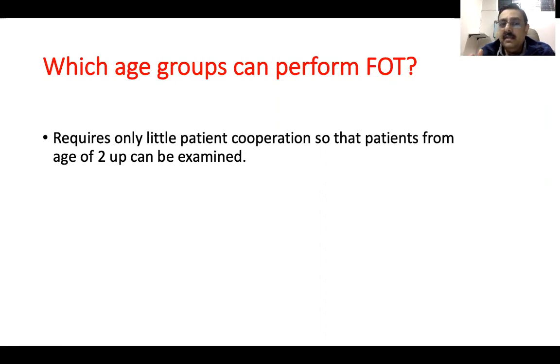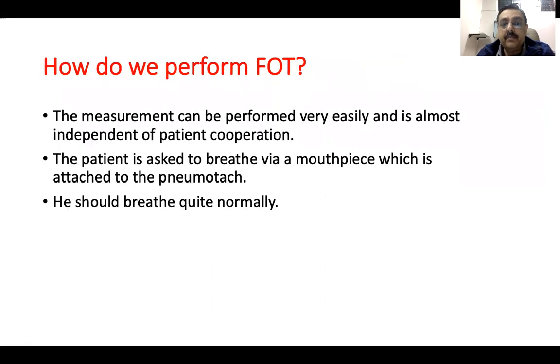It hardly needs any cooperation from the patient, but they still need to hold on to the mouthpiece and should be able to tolerate a nose clip, which you have to put on them. Right. So as I said, it does not require a lot of cooperation from the end of the patient, but still it requires some of it.